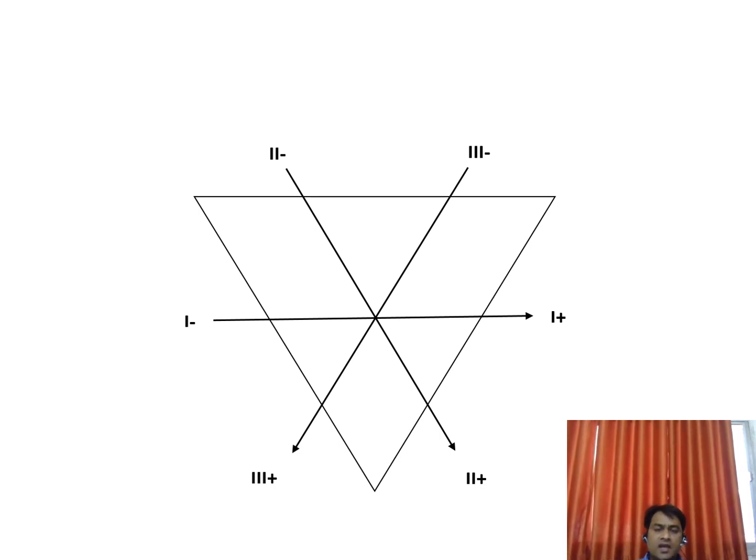So basically, this diagram is showing how, from the Einthoven triangle, we make the arrangement of these leads so that all the leads pass through a common central point. If you rearrange the borders of the Einthoven triangle, they pass through a common central point.